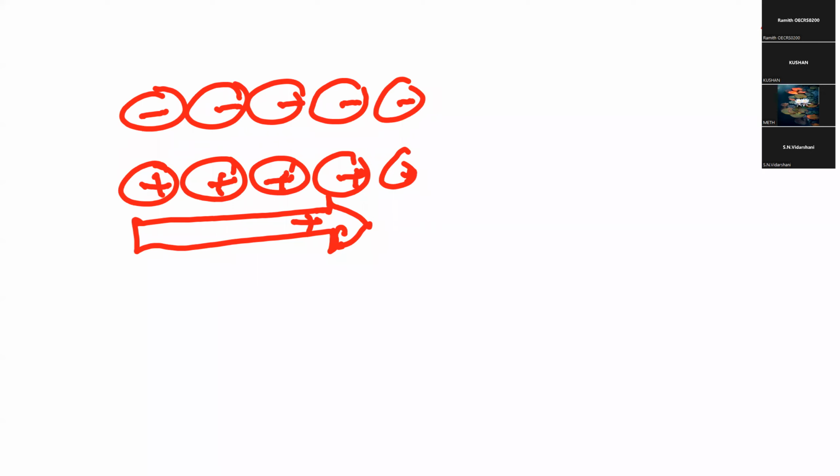Can you remember the name of a galvanometer? Galvanometer, right? Using the galvanometer theory, we are measuring the electric activity of this heart. So, right now we know what electric activities happen in the heart and how the magnet force is created. Now we are going to measure this electric activity. So let's move into the next slide.